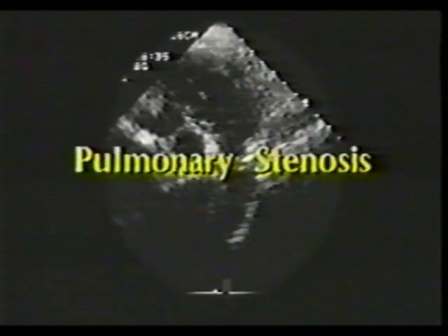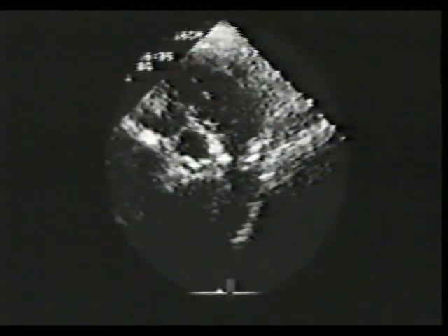We will now discuss 2D and Doppler features of pulmonary stenosis. This is a parasternal short axis view of a 93-year-old patient with severe pulmonary stenosis. This patient presented in severe congestive heart failure with low output syndrome.